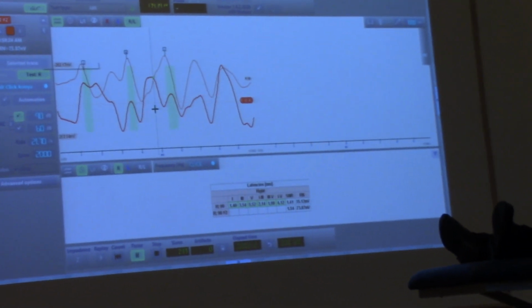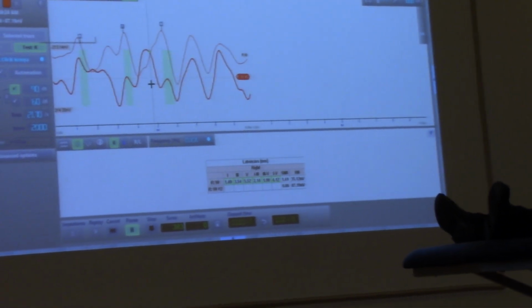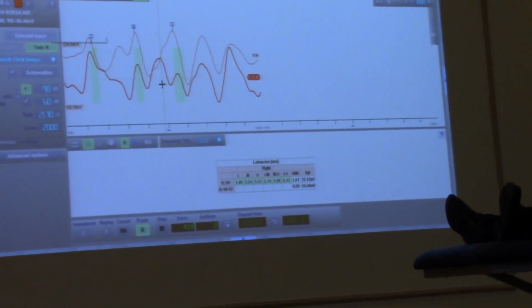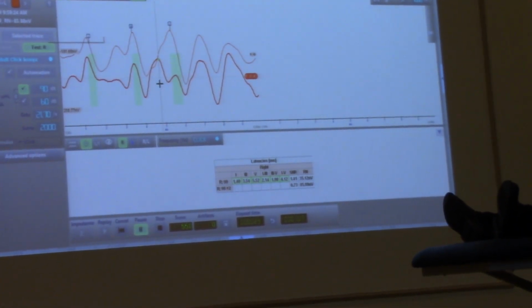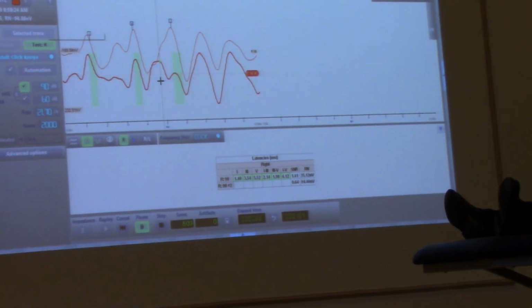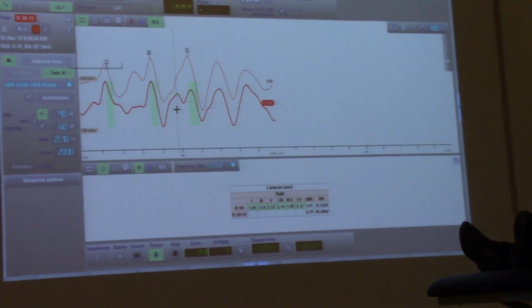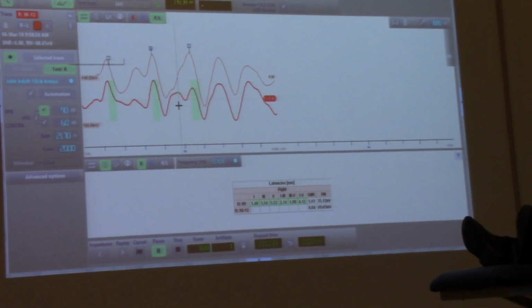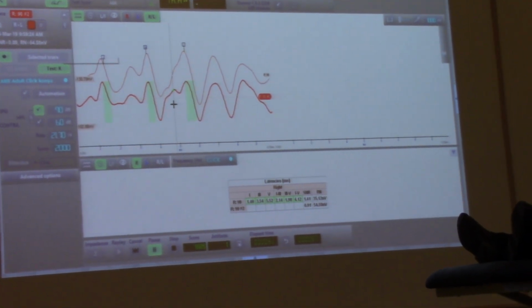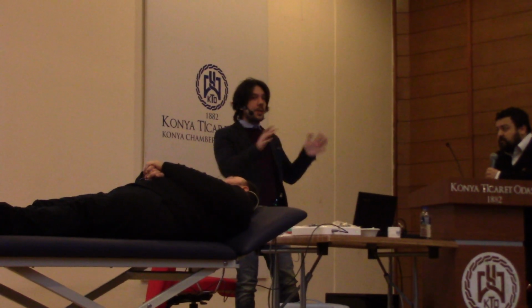Always remember to perform a retest every time. Her zaman aynı uyaran şiddet seviyesine parametreleriniz aynı iken özellikle test tekrarı yapmalısınız. And it's very important that when you do a retest, you always close the test after the same number of sounds. Because you know the signal has variations, okay? And if you want to compare parameters, it's important that you compare them using the same total number of sounds.